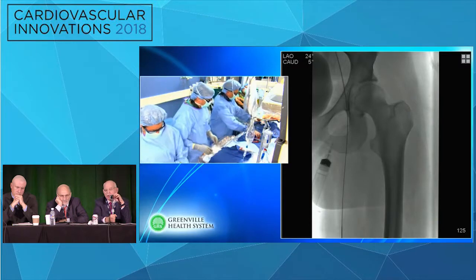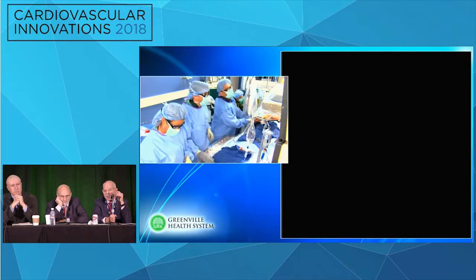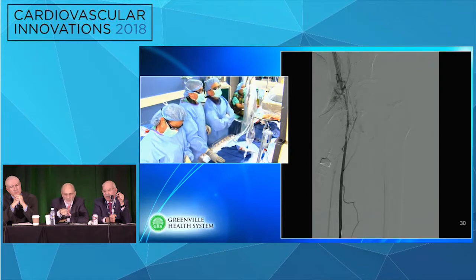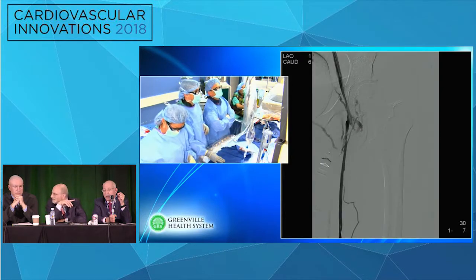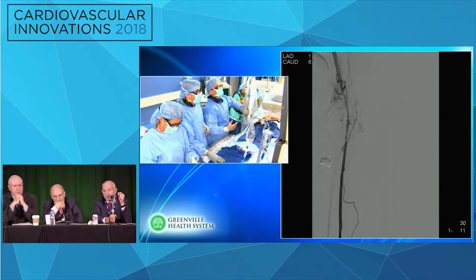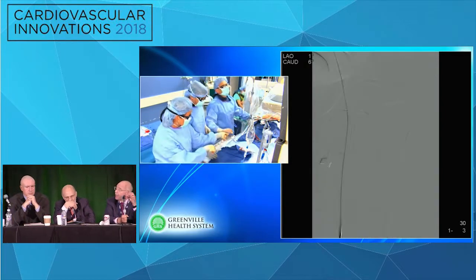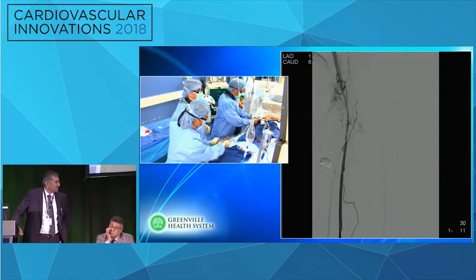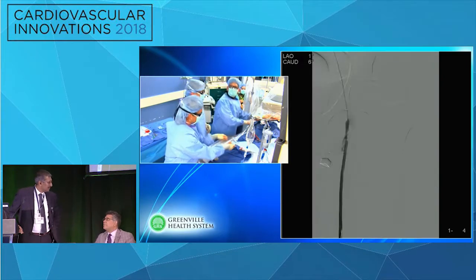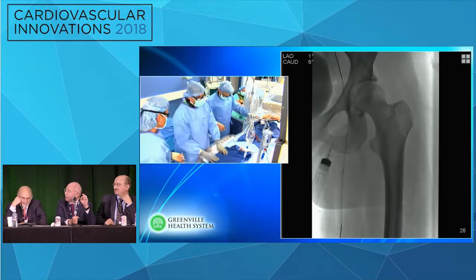So, I would agree actually with Kenny's comments. I'd be reluctant to stent further down unless absolutely necessary. You know, it's interesting because there was flow there. Now it's clearly not normal in that view, and yet it was open enough that he was able to get access and he had flow in it by ultrasound. And it's a relatively low resistance system. So if it stays open and he's open more proximally, then in fact it may stay open without you having to stent across that common femoral segment. So I don't know. I think I would try and fix the upper part first, and then see how it goes. Give me an 8 long balloon, please. 8 long.